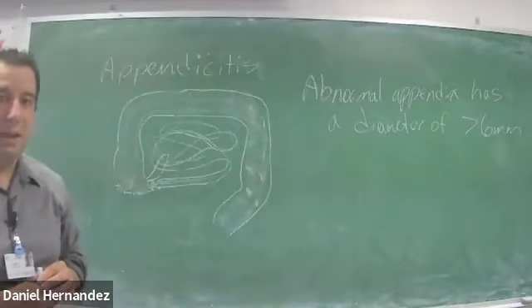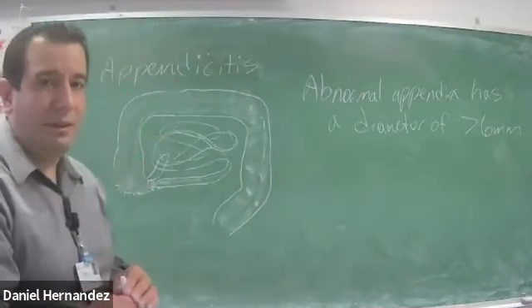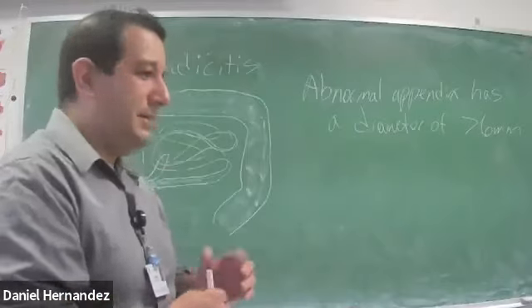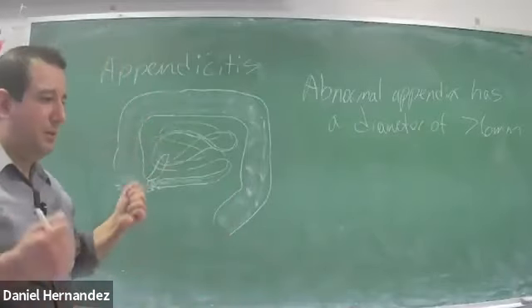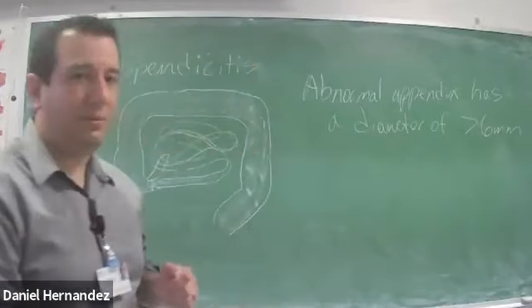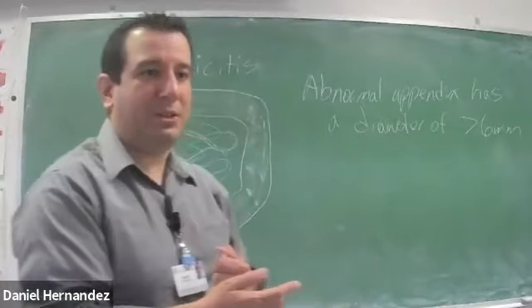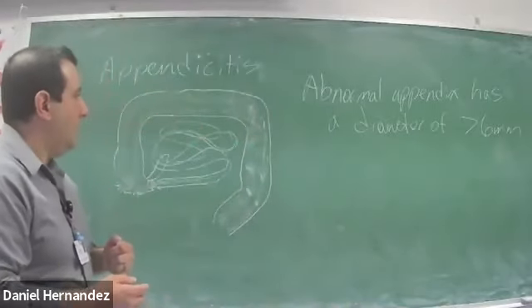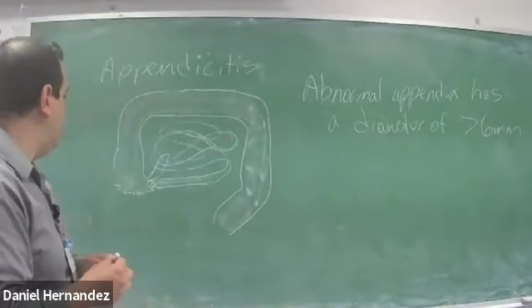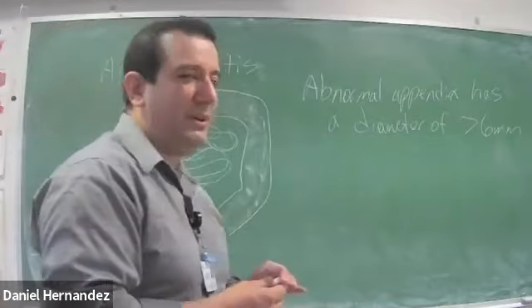So again, they're not always visualized on ultrasound, and it's good to let the parent know that before going in. Sometimes it's not visualized, but we're going to do our best to try and find it. We're trying to avoid radiation from doing a CAT scan, so we like to start with the ultrasound examination. But yes, it's difficult. Not only is the location different on every patient, it's also very small.